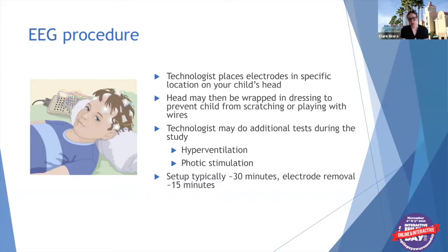And then the electrode removal maybe takes about 15 minutes. And sometimes you may be stuck with a little bit of glue in your hair, but it eventually washes out. Sometimes coconut oil can be very helpful. But all in all, it's a non-invasive study. There's no radiation. And even though we're talking about electricity and wires, there's no shock to your child. We're not stimulating anything. We're just recording. So it shouldn't be painful. It just may be scary. And if the child isn't prepped and doesn't know what they're doing, it can be a little bit scary.